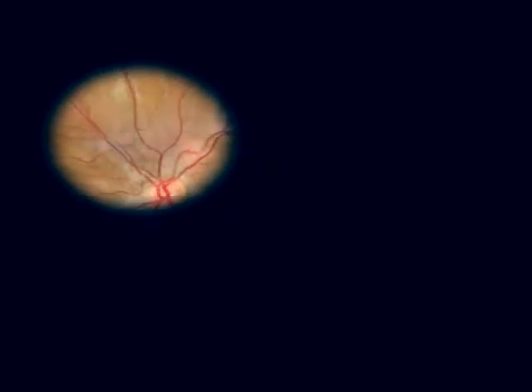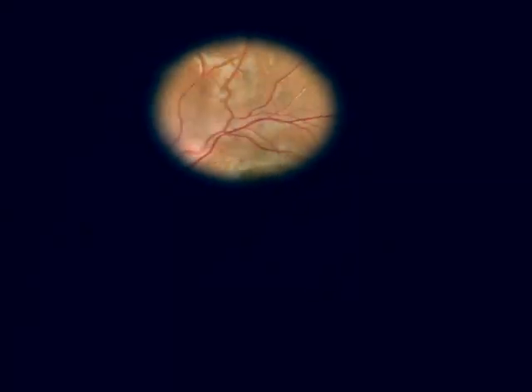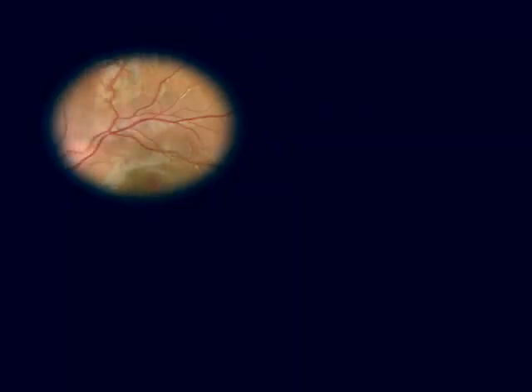Now move the beam slowly along the nasal retinal vessels and then the temporal retinal vessels, looking for hemorrhages, exudates, or other abnormalities. Finally, take a look at the macular region.